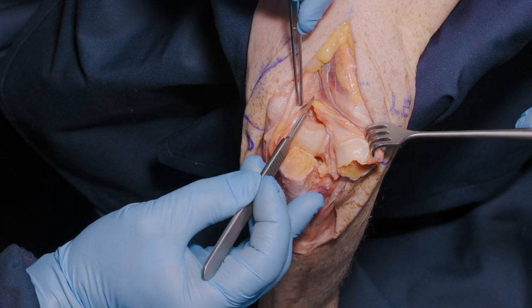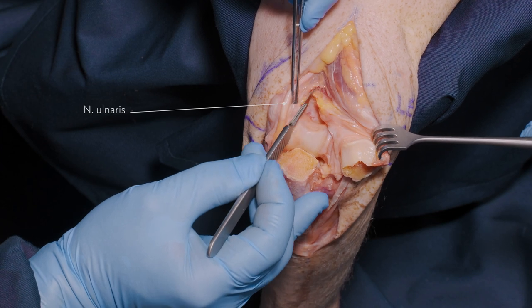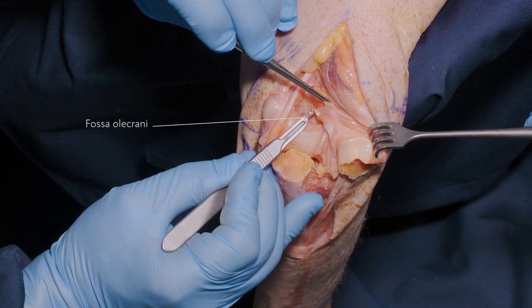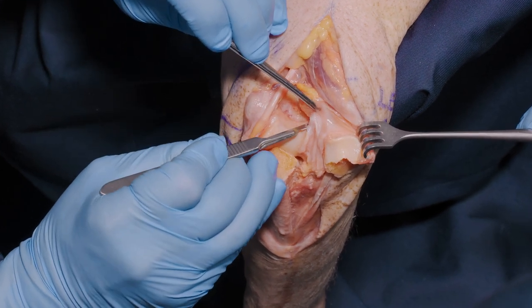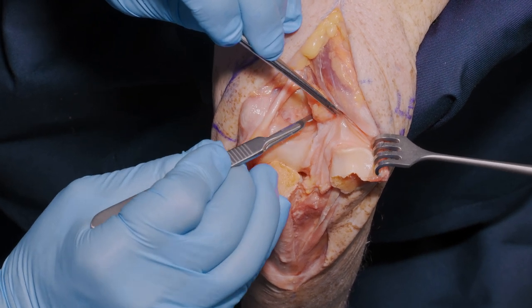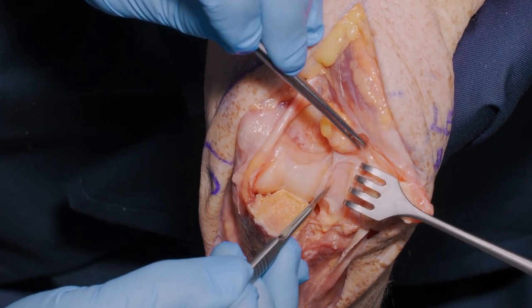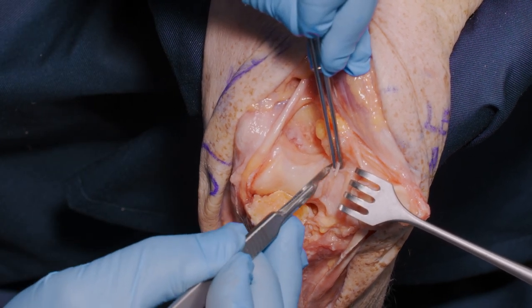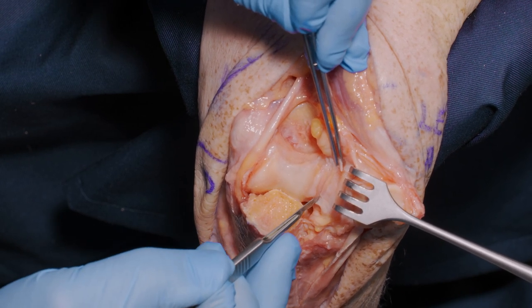As mentioned previously, we keep the bone protected by the fat pad, elevating the capsule from the olecranon fossa and reflecting the capsule from the lateral column. That flip allows us to maintain tissue continuity with the bone.